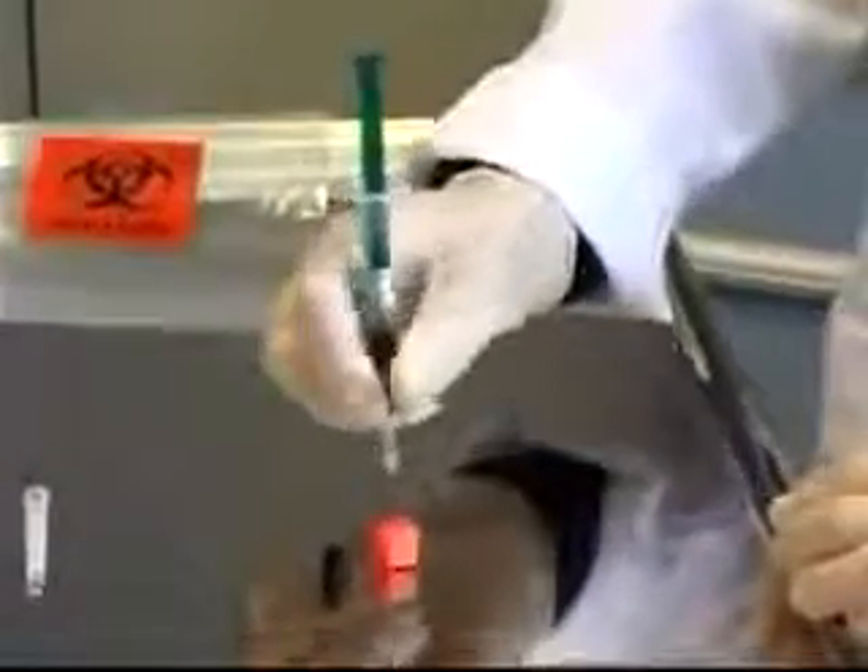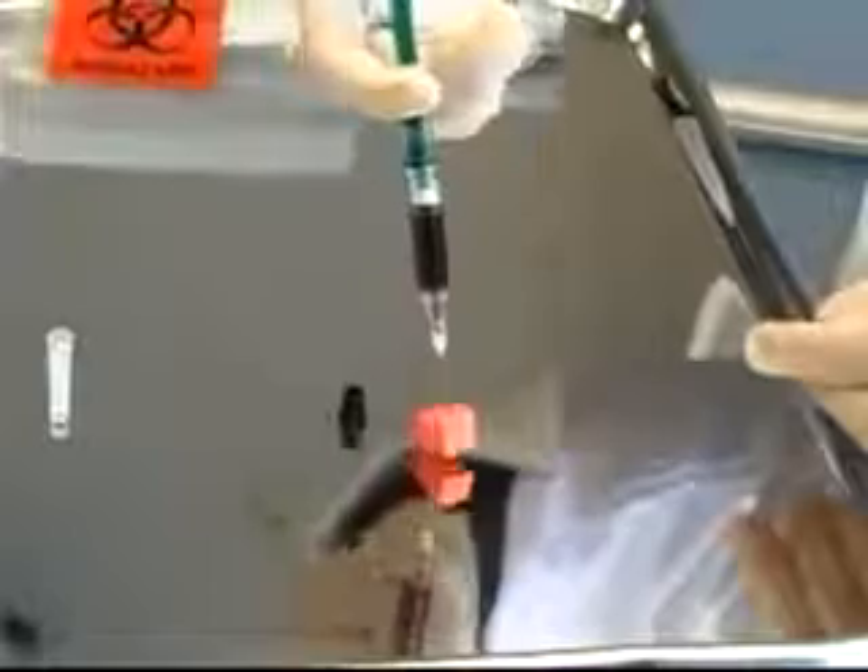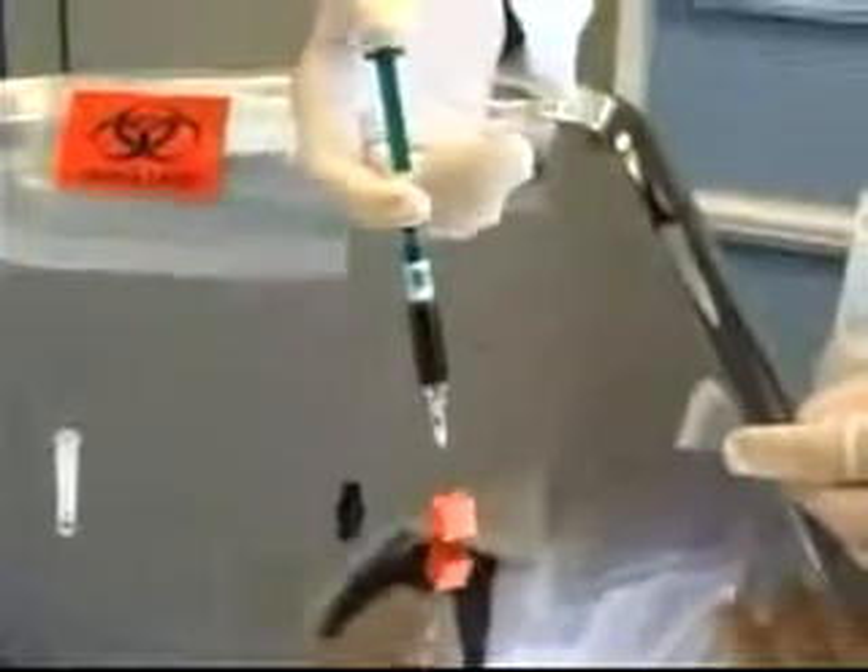While my patient is holding pressure over the site, I'm going to take my needle and syringe over to the air cube and insert the needle straight up and down into the cube, far enough that the bevel is covered but not so far that it goes right through. I push down on the plunger to expel any extra air that might have gotten into the syringe, which could affect the results. I then remove the cube and needle together, attach the black cap to the tip of the syringe, give it a roll to make sure the heparin has dissolved, and place it into the bag of ice to send to the lab.